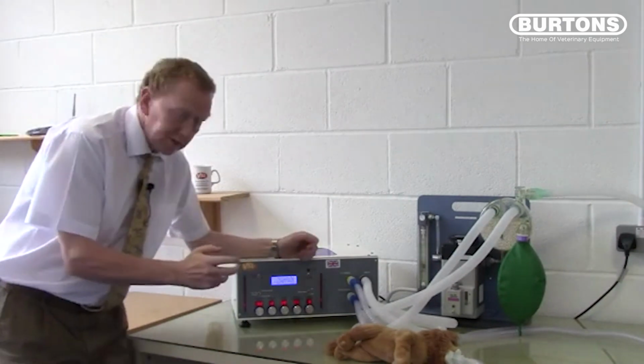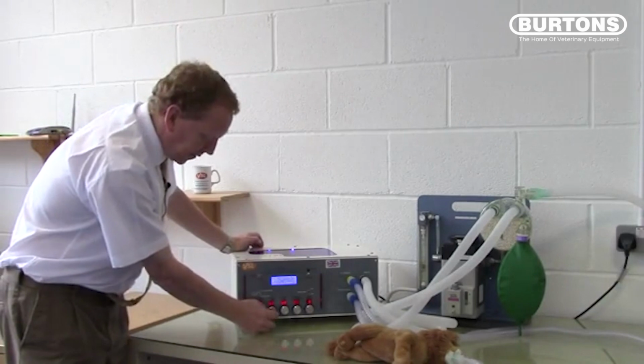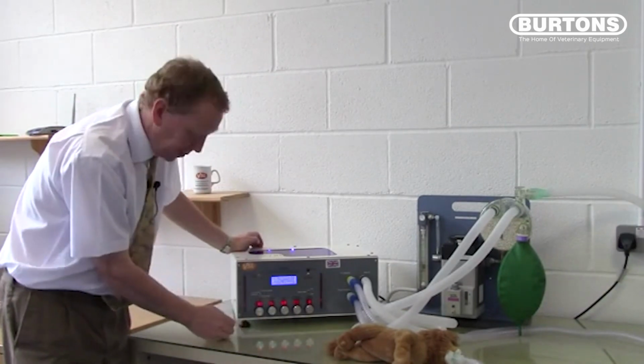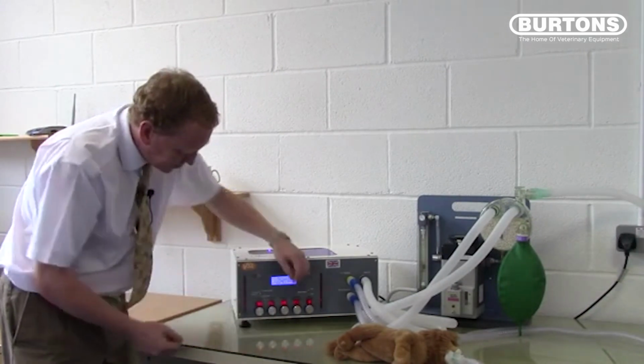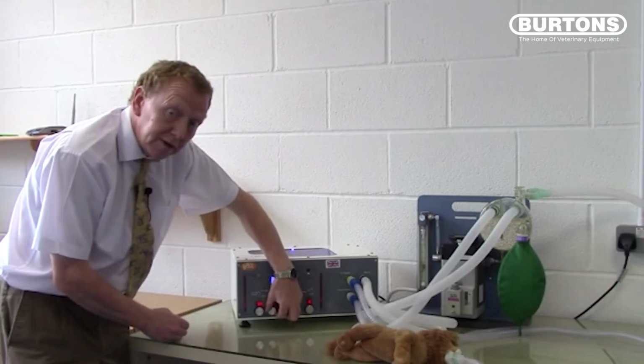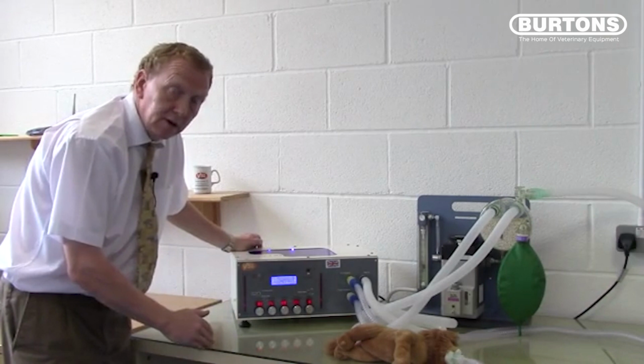To set up for pressure cycling mode, we're going to turn the inspiratory knob completely around to far clockwise as it will go until it says PL, indicating pressure cycling mode. You notice when we do that the volume knob goes from a volume to a flow, because in pressure cycling mode we're going to deliver a fixed flow until we reach a set pressure.